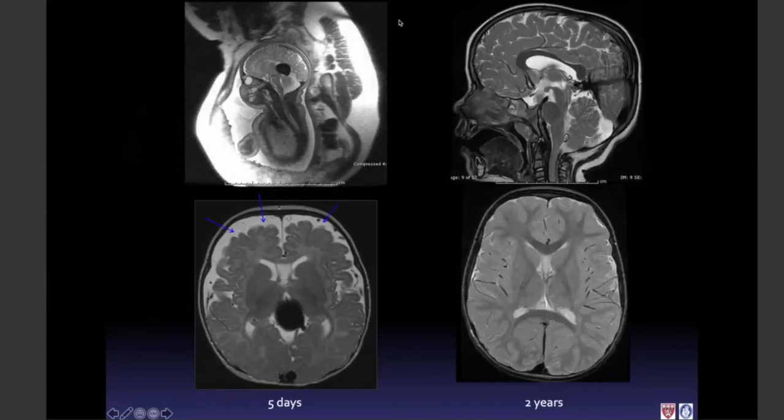Here's another case showing the diagnosis from fetal life, and then the neonatal scan. This is a very different kind of morphology, required a different kind of embolization, but once again, not embolizing the prosencephalic vein itself, just the arterial inflow and maybe the early part of the vein results in complete involution of that vein eventually, and a great outcome for many patients.